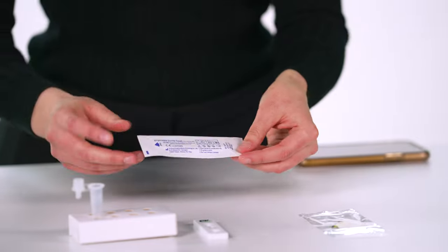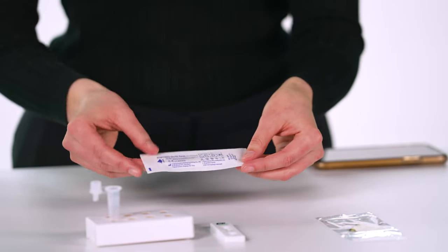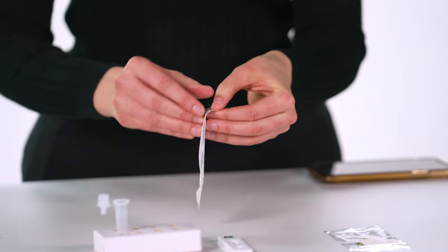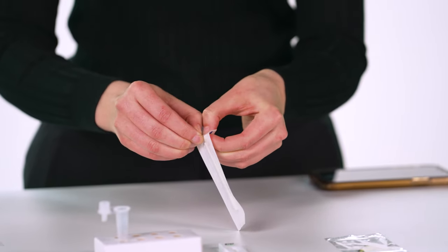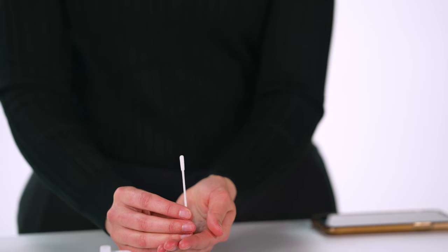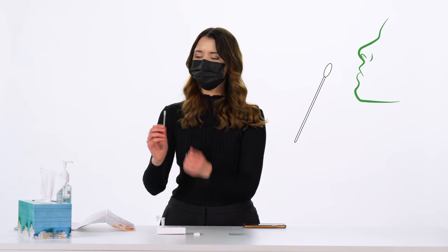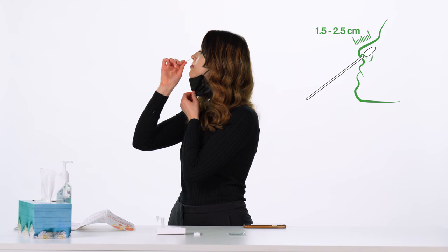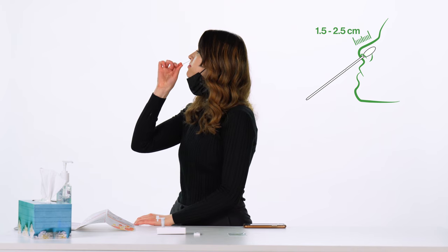Check that the swab wrapper is properly sealed. When you are ready to use the swab, peel open the packaging from the indicated end and hold the swab by the stem. Do not touch the padded tip of the swab to yourself or any surface. Insert the padded tip of the swab about one and a half to two and a half centimeters — a half inch to one inch — inside your nose.